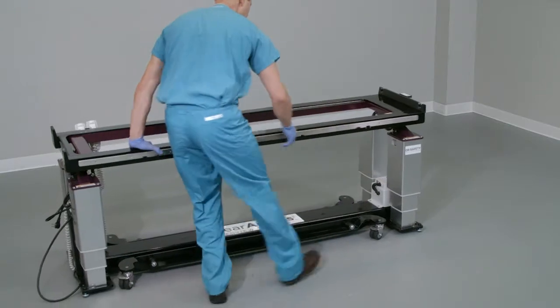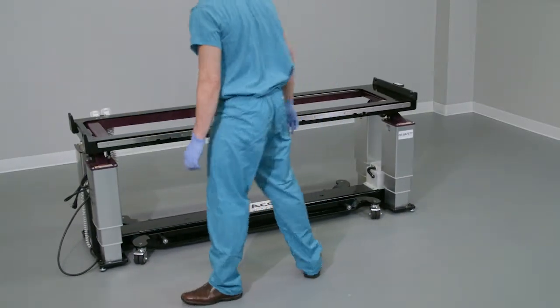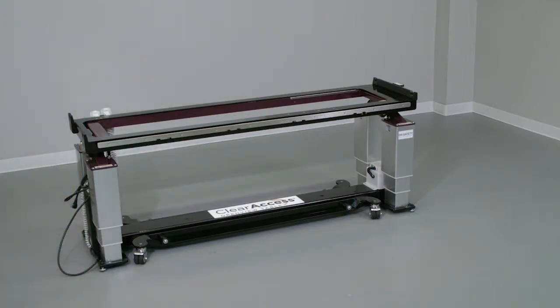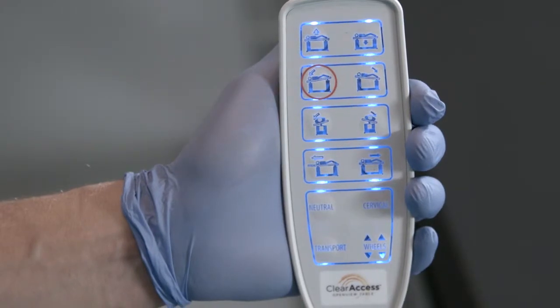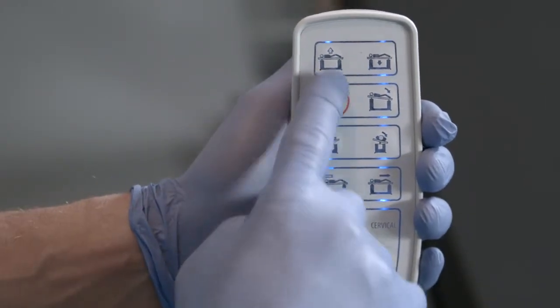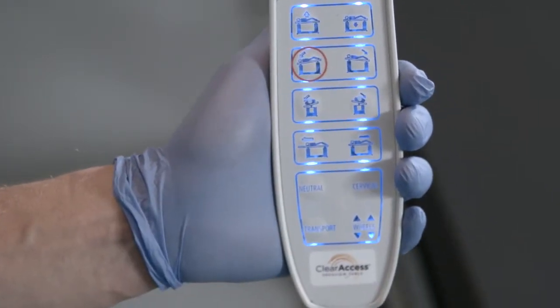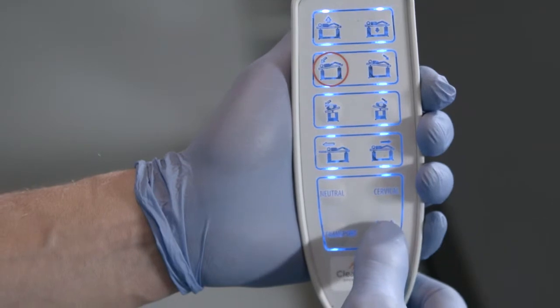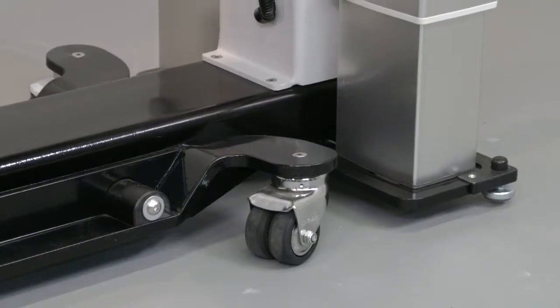Move the ClearAccess table to the preferred location in the OR. To lock the table to the floor, press any button on the hand controller to wake it. Both hand controllers will auto sleep if inactive for 30 seconds. Press any button to reactivate and then lock the table by pressing the wheels button firmly once and releasing. You'll note an audible beep as the table is lowered to the ground, warning caregivers to keep personnel and equipment clear of the table.